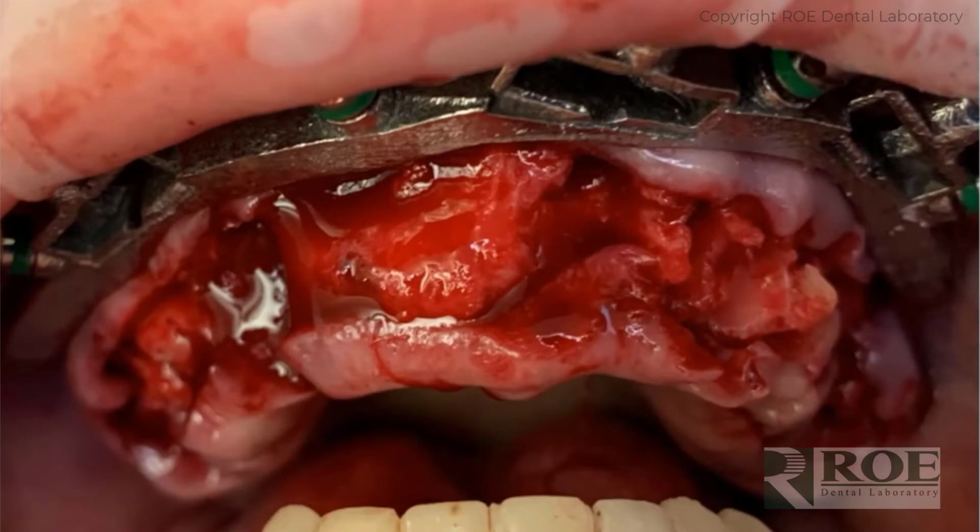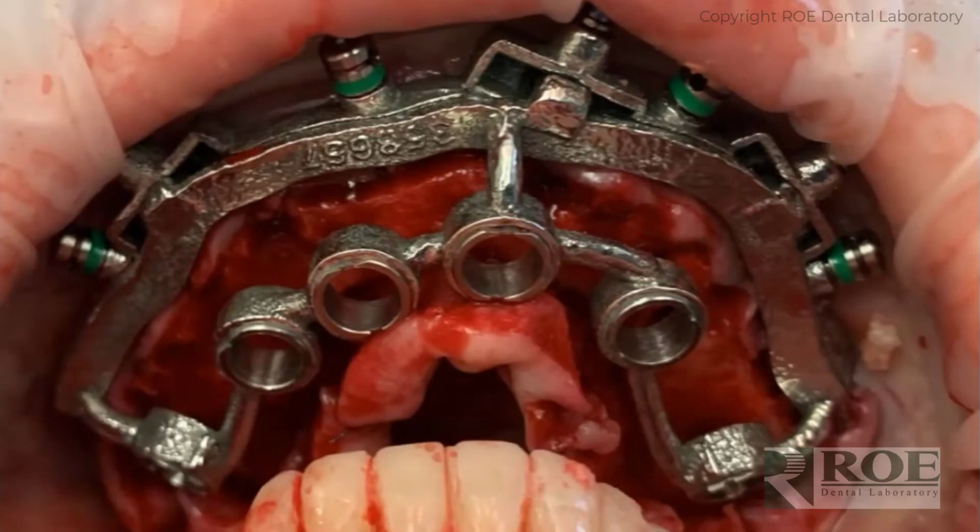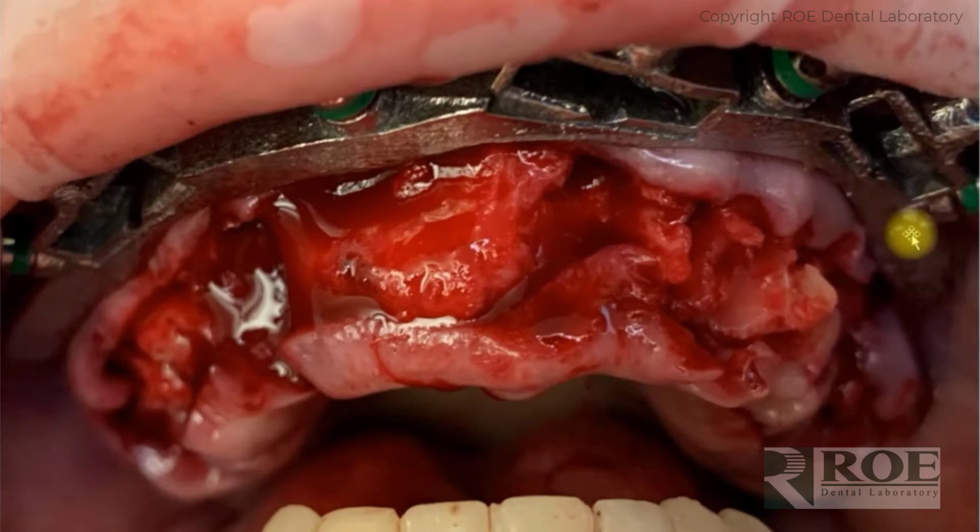So once the fixation base is in, then the doctor will reduce the bone. I'm getting a little ahead of ourselves here. Reduce the bone. There was not a photograph of that completed, but the bone is reduced down to the level of the fixation base. So you're going to get a little tissue here in the way. You can probably just tuck that down in.